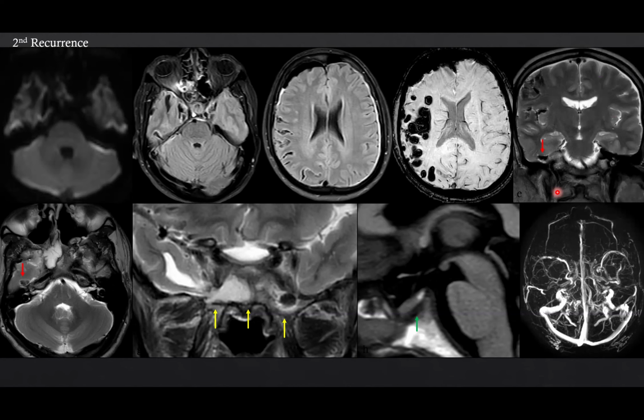Now, this overdrain of the thecoperitoneal shunt is apparent because his intracranial hypertension has now got converted to intracranial hypotension. So while reporting any of these such cases, this is what one needs to always keep in mind.